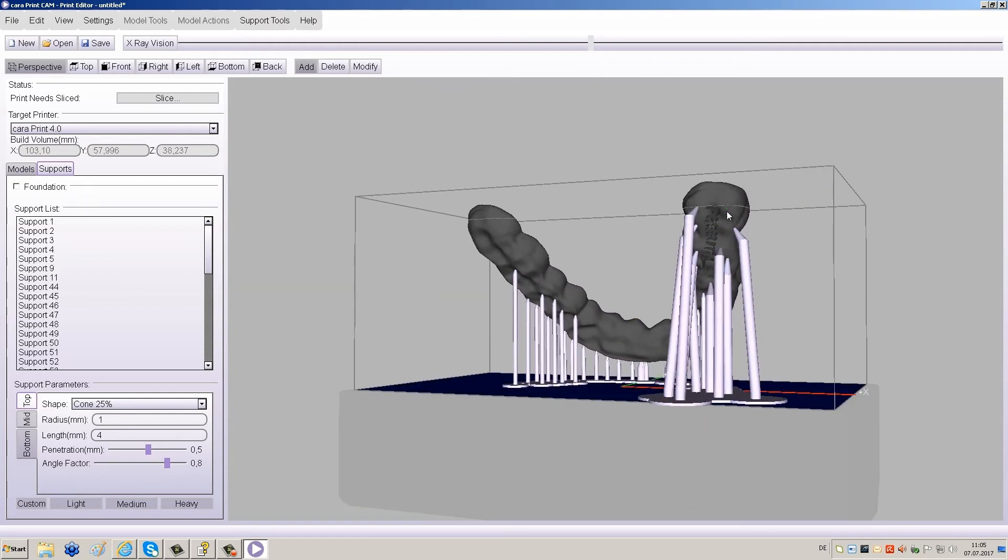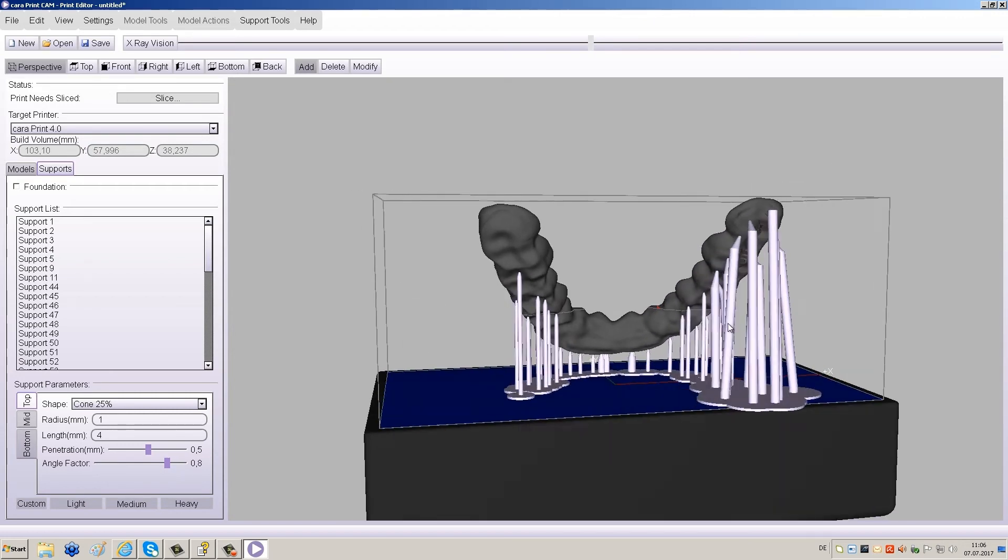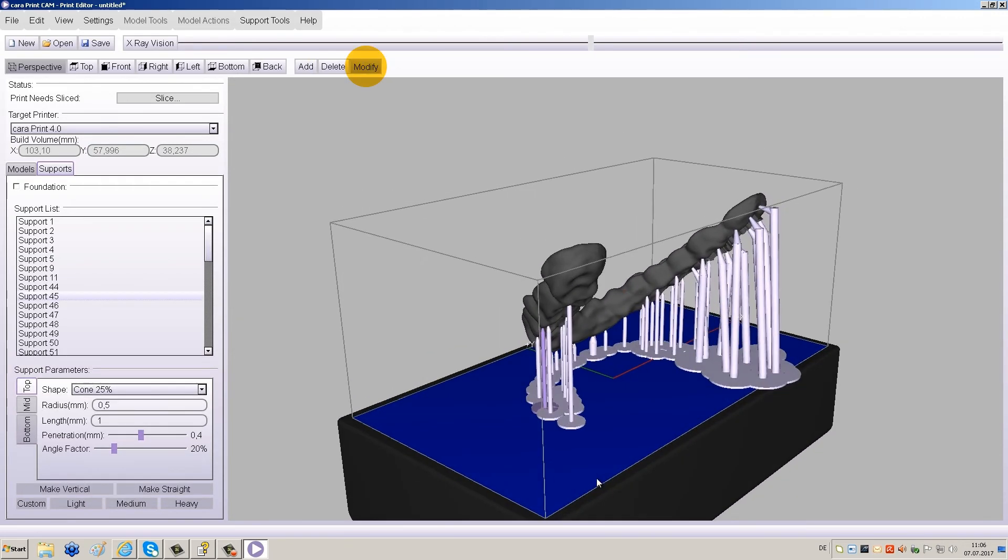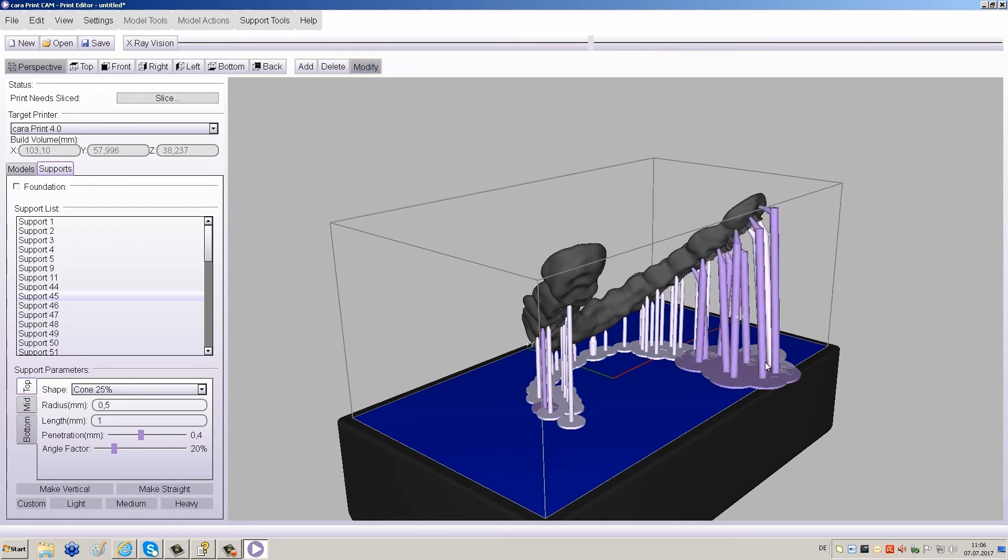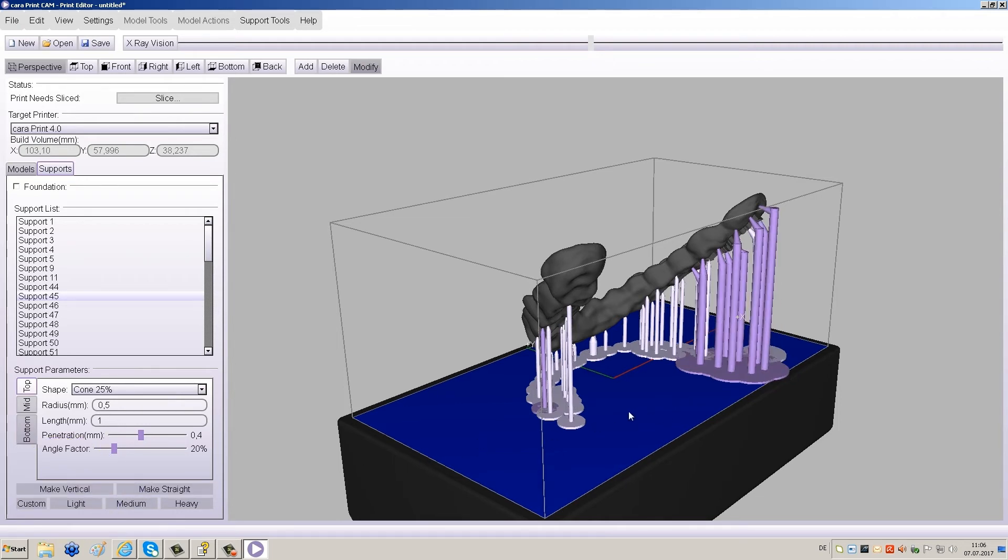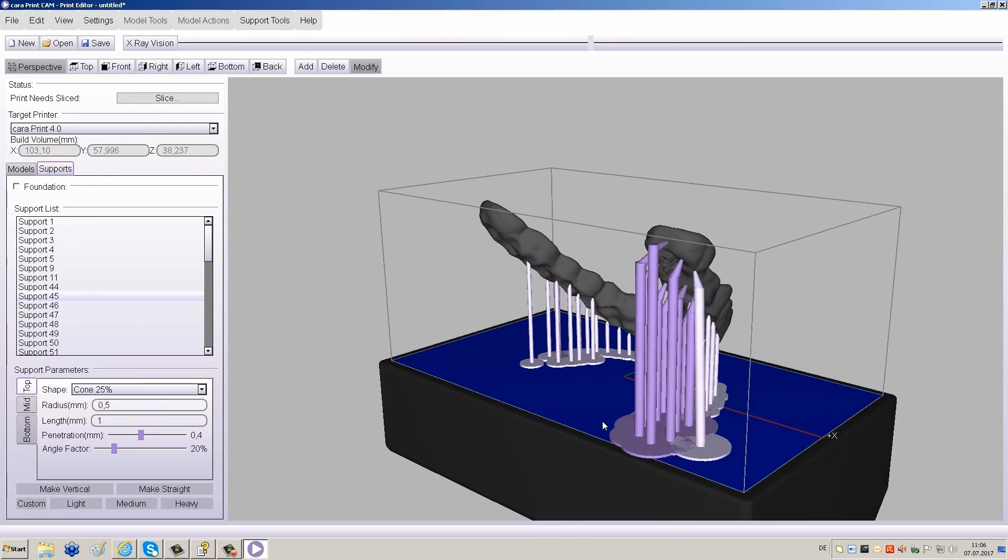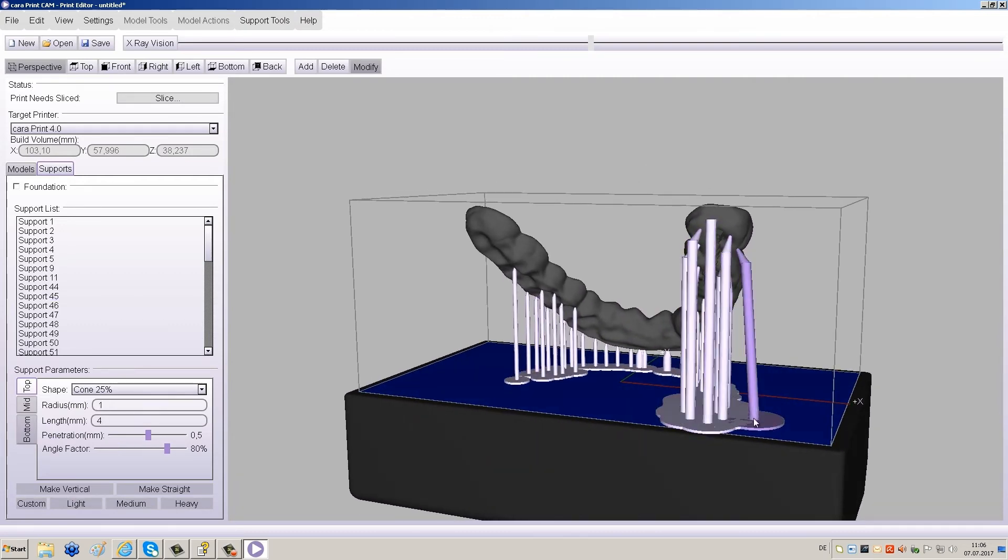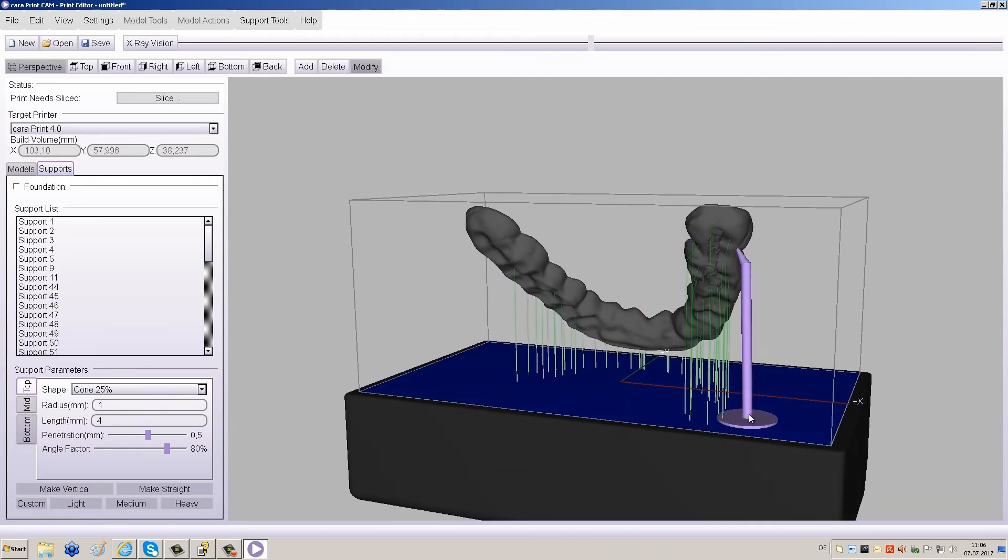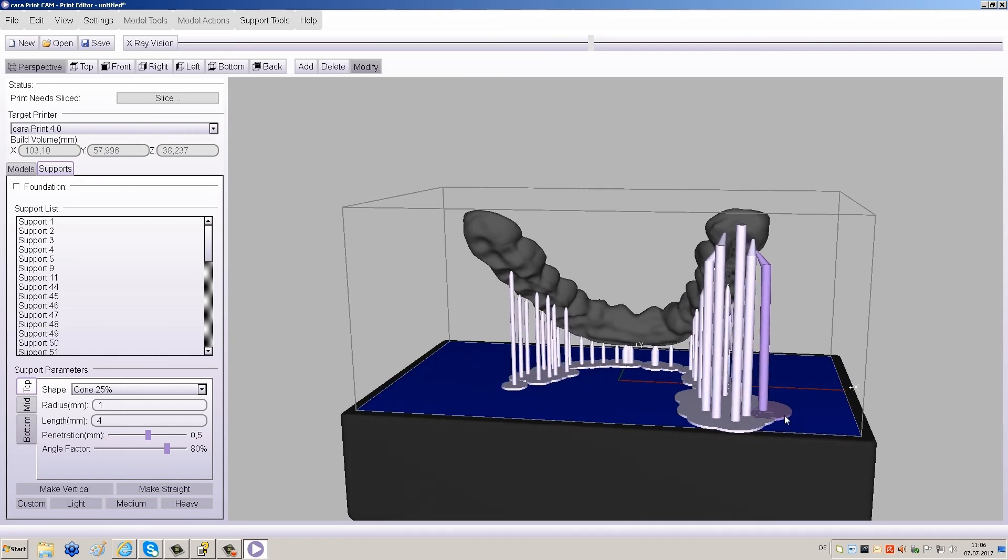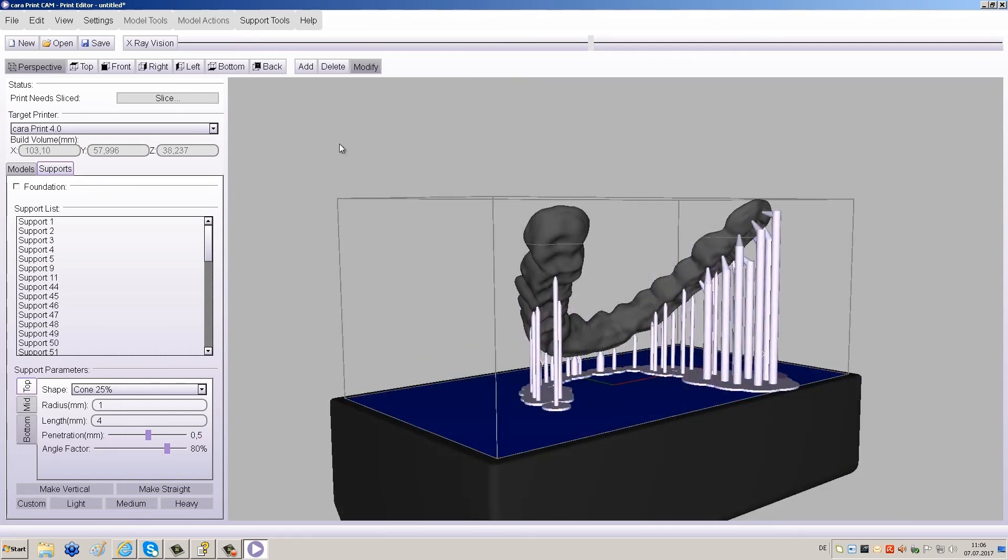Next, you can add supports to the restoration by clicking on the desired positions. Click Modify at the top of the screen and select the new supports. Click Make Vertical to the bottom left of your screen. This makes the supports run parallel to one another and saves space within the building platform. Follow the same process for the other side.